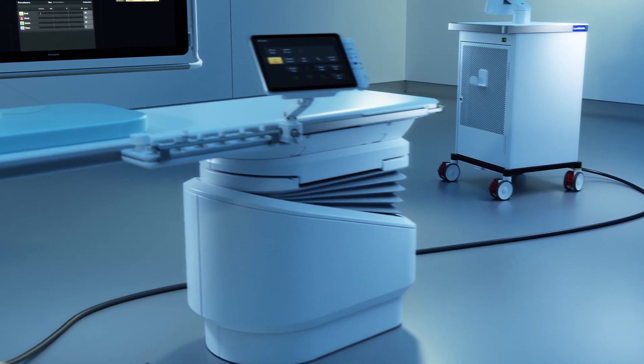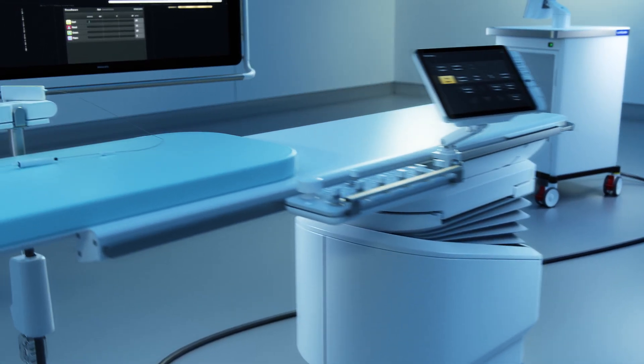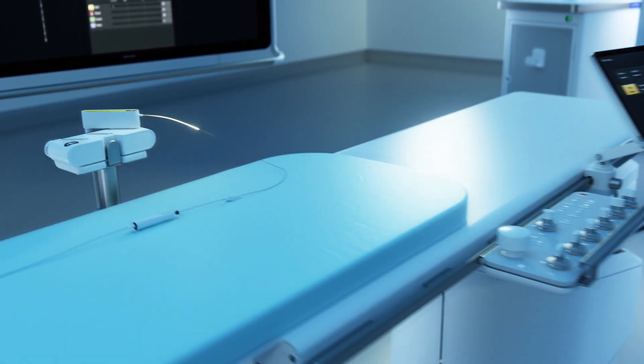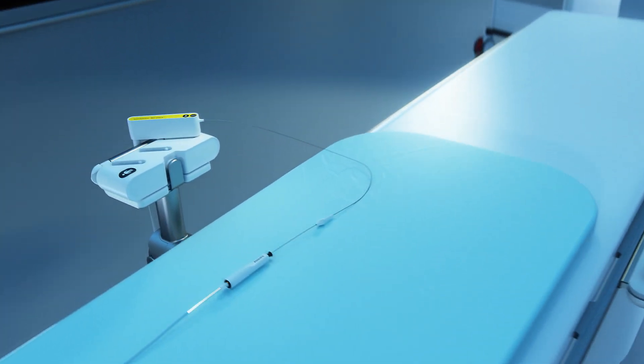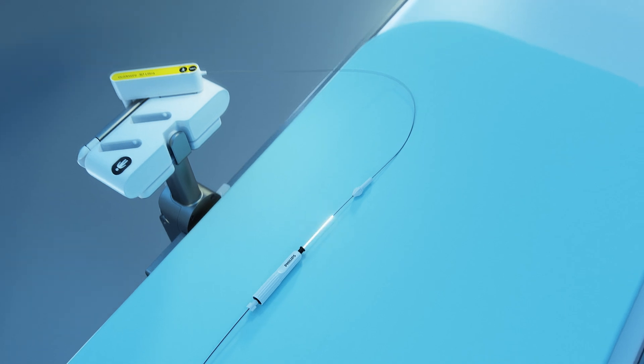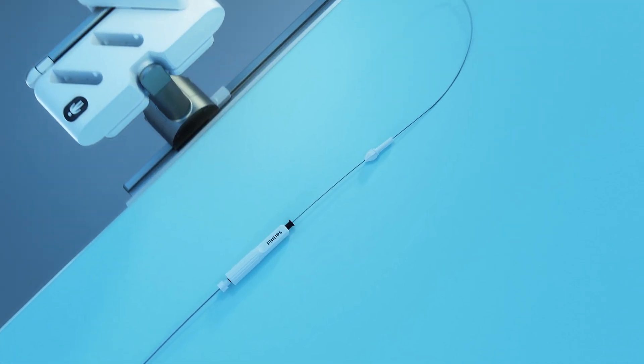This laser light travels to a table-side docking base, then back and forth through a FORCE-enabled guide wire.